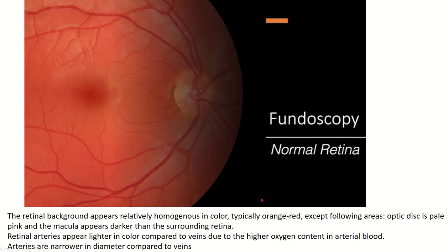The retinal background appears relatively homogenous in color, typically orange-red, except at the optic disc where it is pale pink, and at the macula where it appears darker than the surrounding retina. Retinal artery is lighter in color compared to the vein due to the oxygenated content in arterial blood. The artery is also smaller in diameter than the vein.